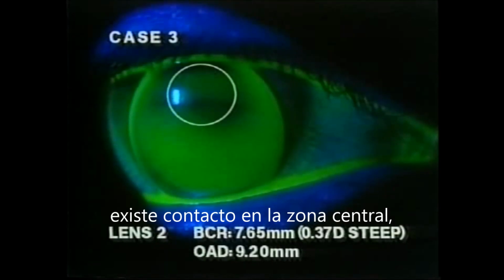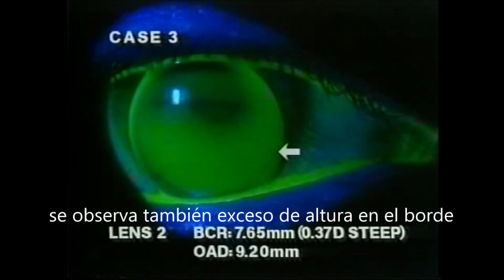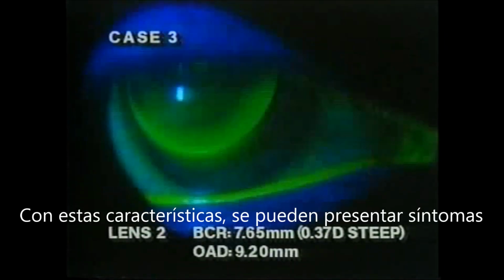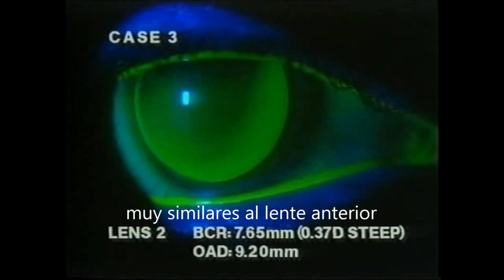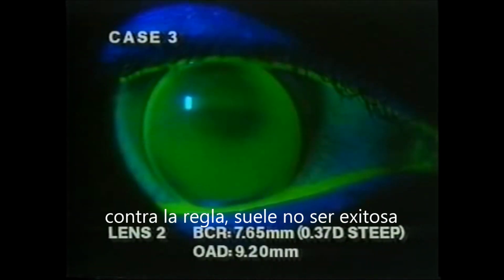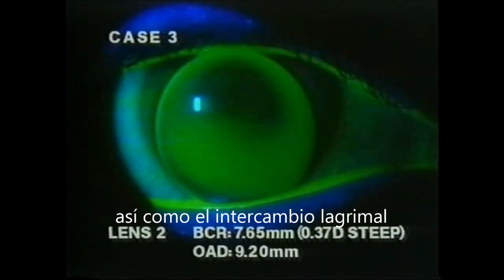Apical touch is especially apparent after the blink, when the lens drops inferiorly. Excessive edge clearance can also be observed. Similar symptoms and clinical signs regarding an inferior decentering lens would apply here. The application of a spherical base curve lens on a moderate or high astigmatic cornea can result in poor alignment and a rocking effect of the posterior lens surface against the tear layer.